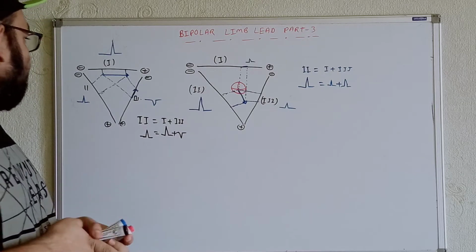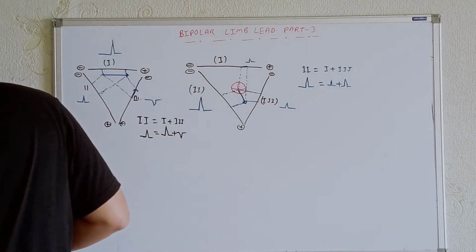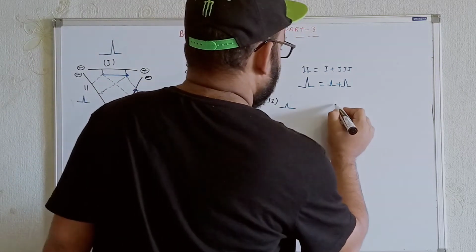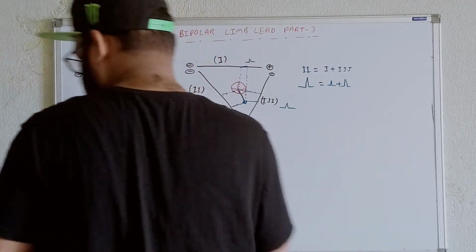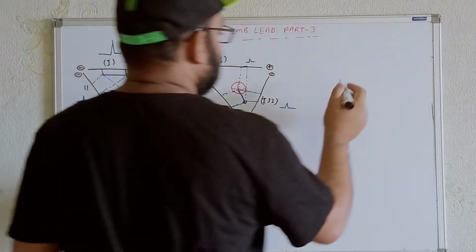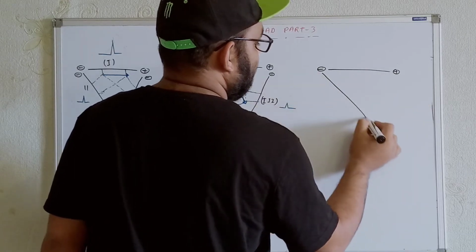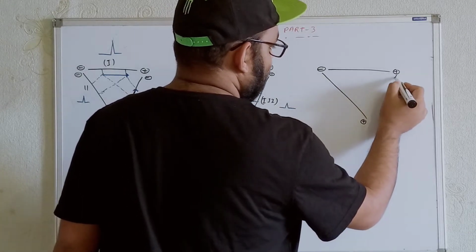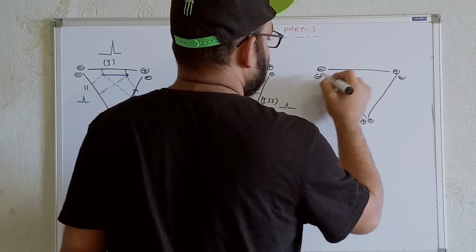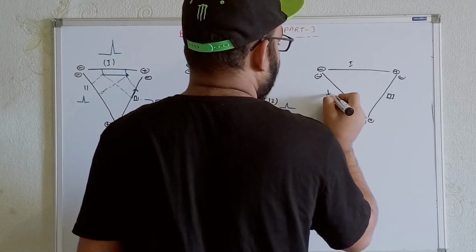Now we will talk about another kind of major ventricular depolarization in another direction. Let's show that. Now for example, I am just drawing over here. Okay, I am erasing this part, guys. So I think it will be easier for you to understand the rest. Now for example, I am just taking the negative, this is the first lead, positive over here, I am getting lead number 2, and from here we will get lead number 3. So negative, it is negative also. This is lead number 1, this is lead number 3, and this is lead number 2.